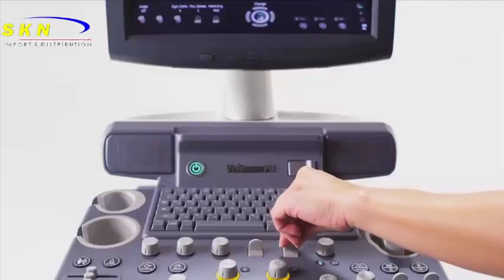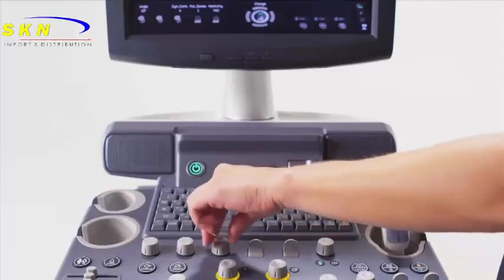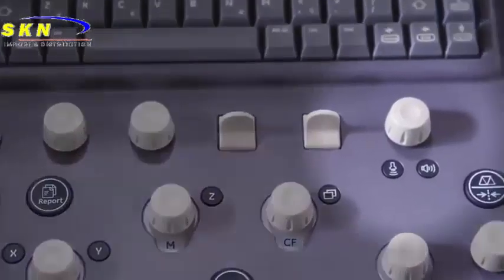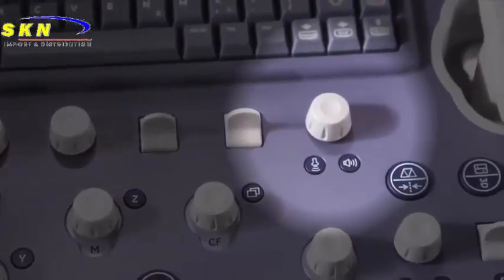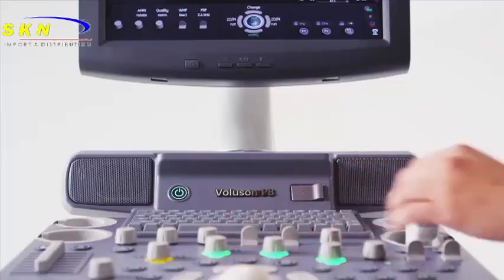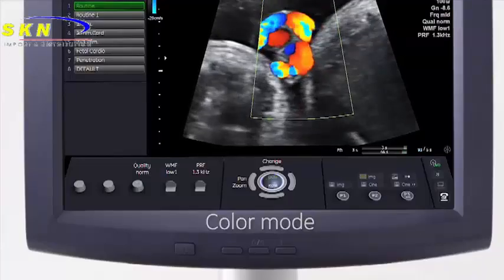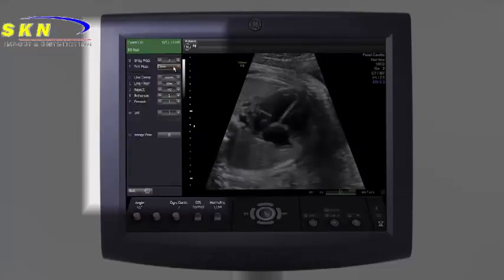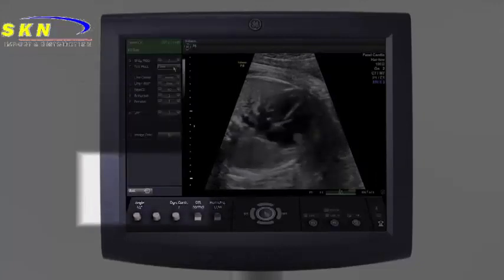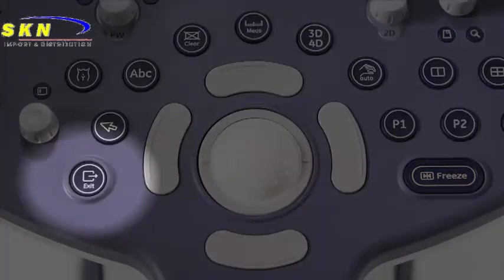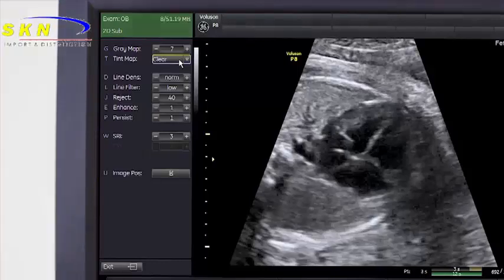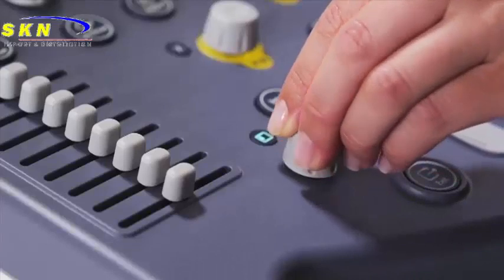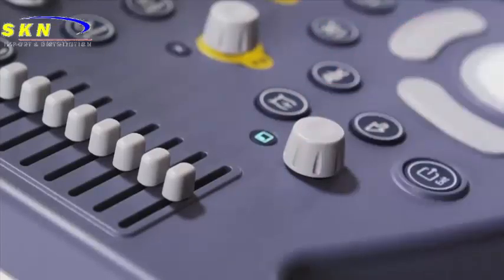The top row of knobs and toggles control the on-screen menu. This menu is dynamic based upon which scan mode is selected. The acoustic output and system volume share the same control knob. During live scanning, the display menu is also dynamic based upon which scan mode is active. Additional functions can be found in the submenu. Exit the submenu by selecting Exit on the screen or selecting the Exit hard key next to the trackball. All menu items can be activated by selecting the alphanumeric shortcut indicated on the left, or by the navigation control knob on the left side of the console with a turn and press action.